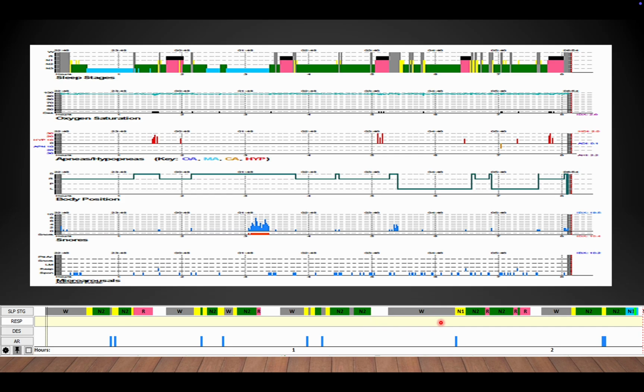And it makes the diagnosis difficult in some situations. Hence, what we did was exclude this one and take this one, and the mean sleep latency was then within less than 8 minutes. So what I am trying to say is that anything which can alter the normal situation can dramatically change the sleep report or the MSLT report.